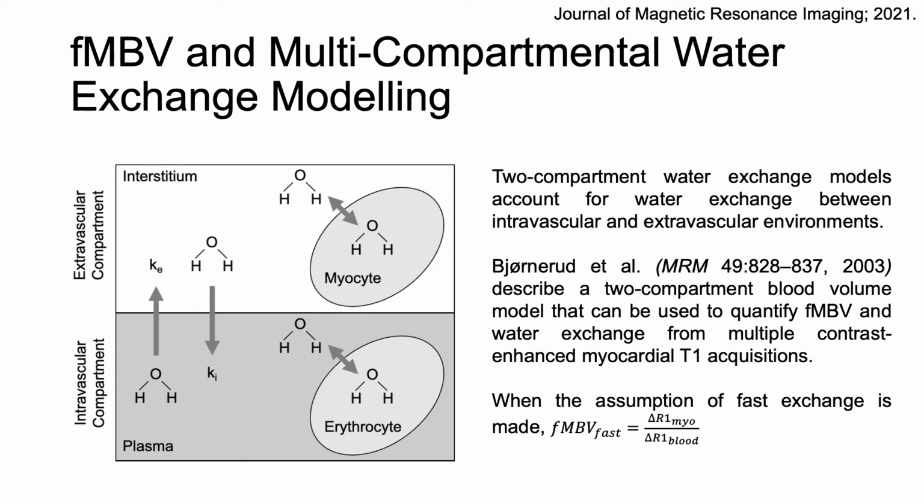A two-compartment model of myocardial tissue typically treats the myocardium as being made up of two physical spaces, which correspond to two spin relaxation environments, the intravascular and extravascular compartments. Ferumoxytol, being a purely intravascular contrast agent, does not leak out of the intravascular compartment. However, unbound water is free to diffuse between compartments. The fraction of this hypothetical voxel that's comprised of the intravascular compartment and the exchange rate of water across the vessel wall both affect the MR signal of this voxel.